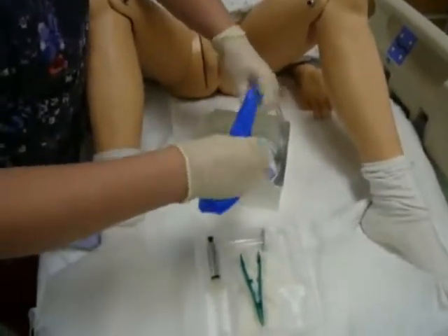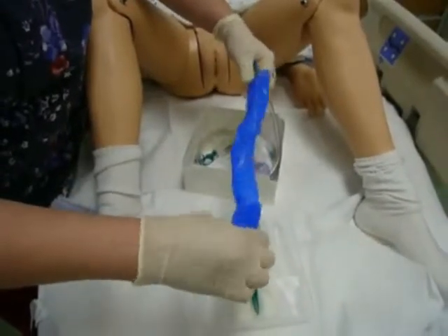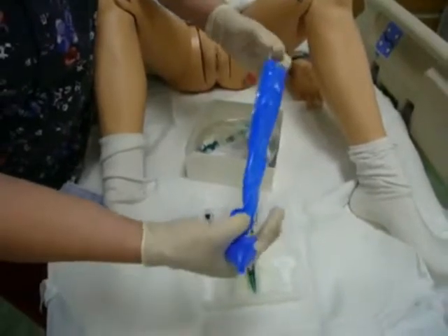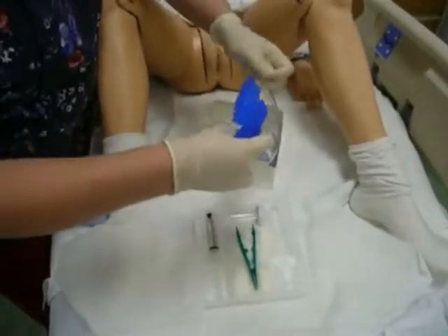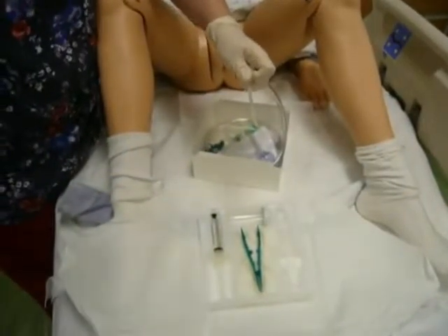So when you take this blue covering off, you need to make sure that you have control of your catheter the entire time so that it doesn't flop off of your sterile field. So you'll see I'm pulling it with my right hand while my left hand is making sure that I take the sterile catheter to make sure it's not flopping around.